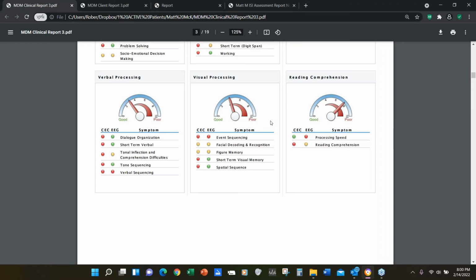And they look at me and go, how did you know that? And I say, because you've told me they have these symptoms and the map is pointing to the fact that they're agreeing with a lot of what you've said, and that's what we would expect. They're not capable. It's not that the kid is necessarily oppositional. They're really more incapable of doing it. Their brains function such that they need those constant reminders. Buy yourself a bunch of 3M stickies and put them in the bathroom, in the kitchen, at the front door, whatever.